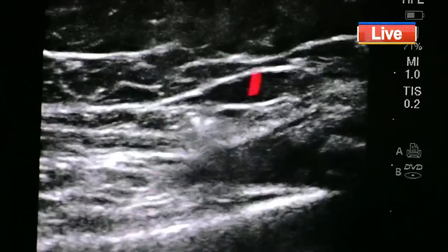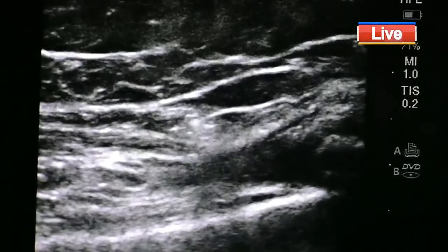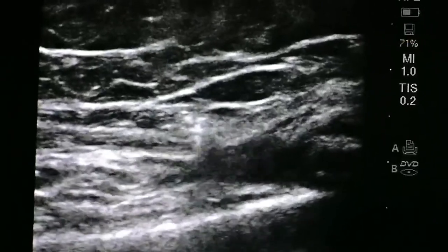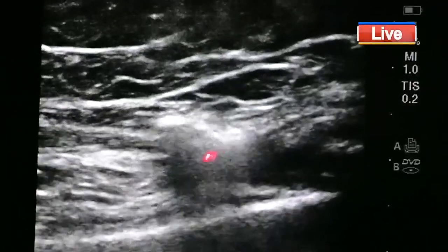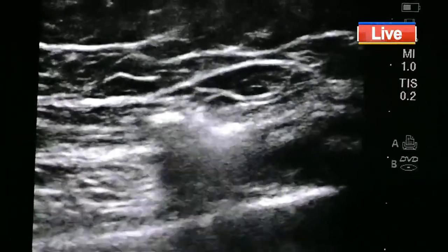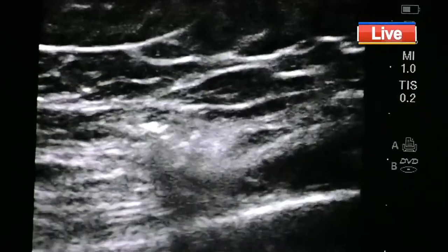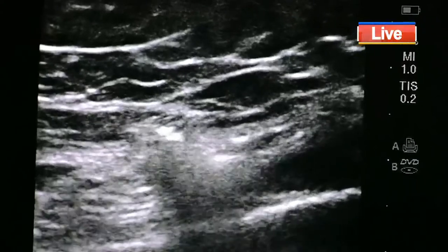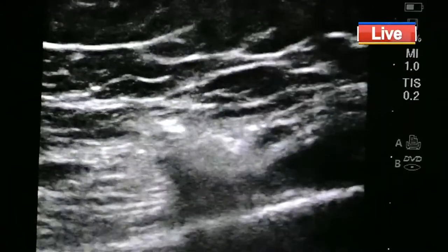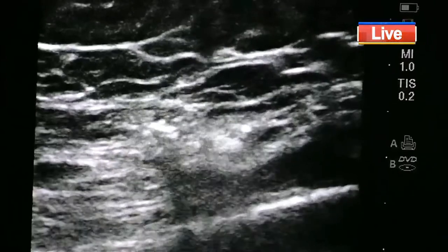I am very close. You can see now I have just hit the periosteum. There will be a little pain now, for one second. Okay, aspirate. Aspirating. Negative. Yes. So I'll go down. Further. Wait. Local. I cannot see now because I cannot change my middle position. Still pain? Okay, no problem.